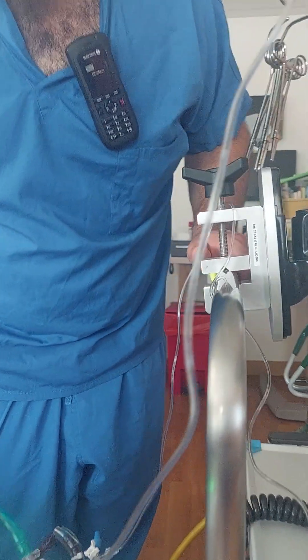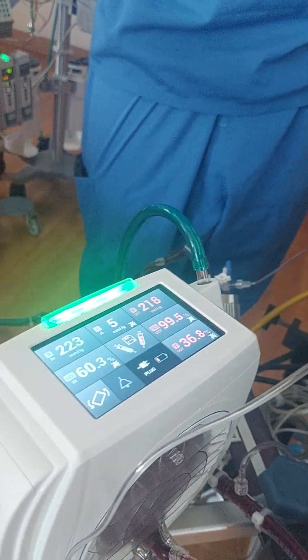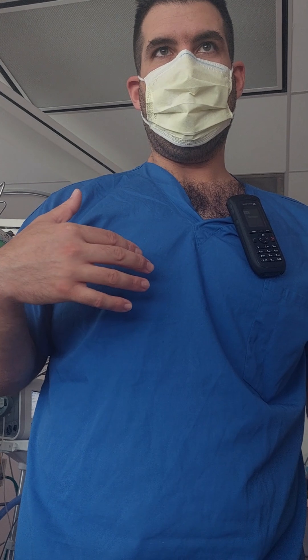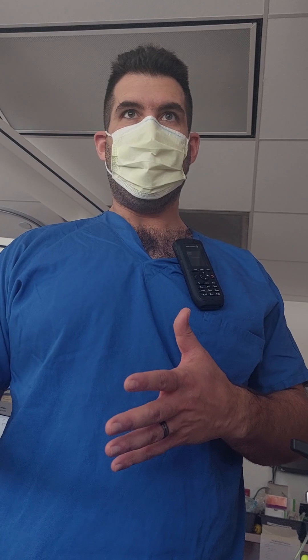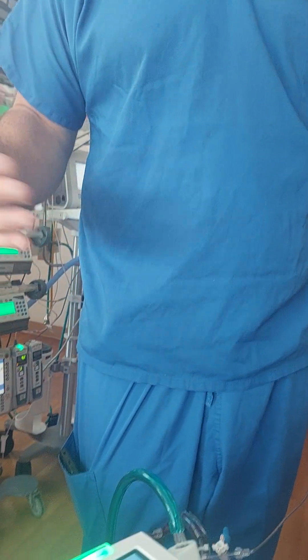The same circuit can be used for both VA and VV modes. The only difference is where you're draining and returning the blood: in VV you drain and return blood within the venous circulatory system, whereas in VA you drain from the venous system and return to the systemic circulatory system. The same membrane, pump head, and tubing can be used for both VA and VV ECMO purposes.